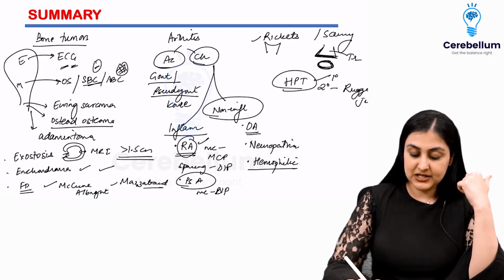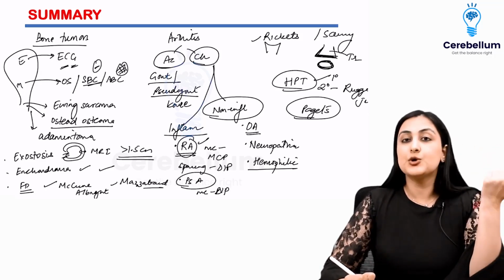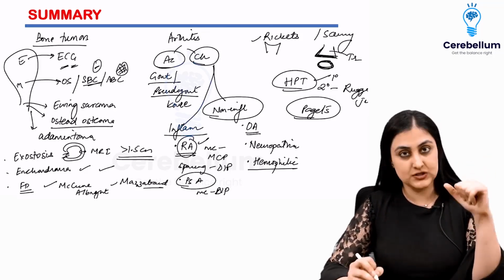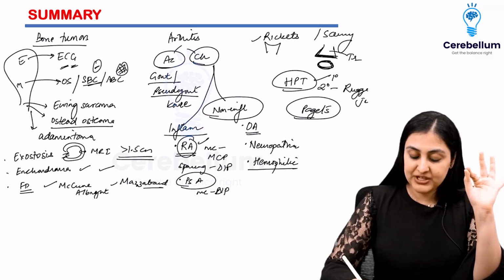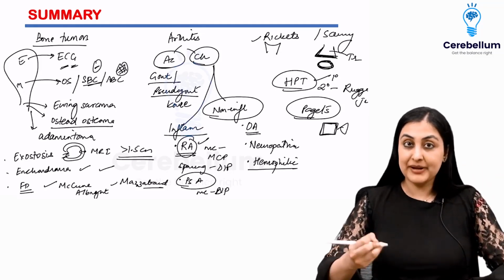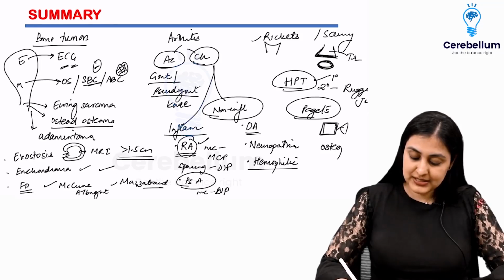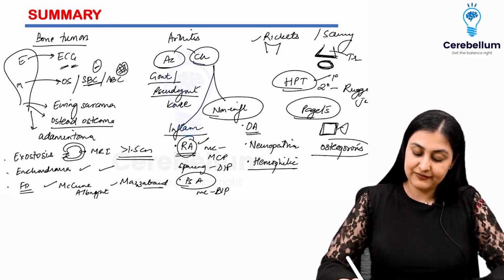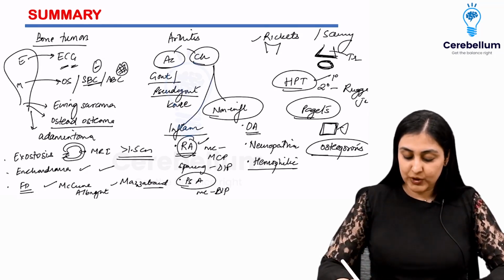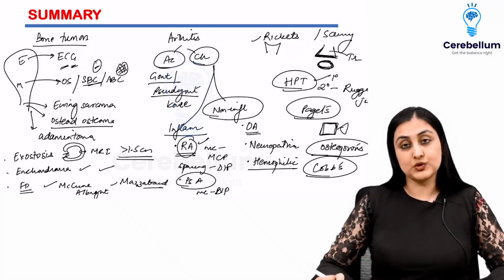Alright, then we discussed Paget's disease being important. So it can have lytic, blastic or a mixed phase. So in the skull, you have cotton wool skull or osteoporosis circumscripta. You can have a picture frame vertebra showing you both of the changes, right? So that's Paget's disease for you. Also remember, osteoporosis is very, very important. So you will have DEXA being the investigation of choice here. Finally, you want to remember that Cobb's angle is what is used for scoliosis.